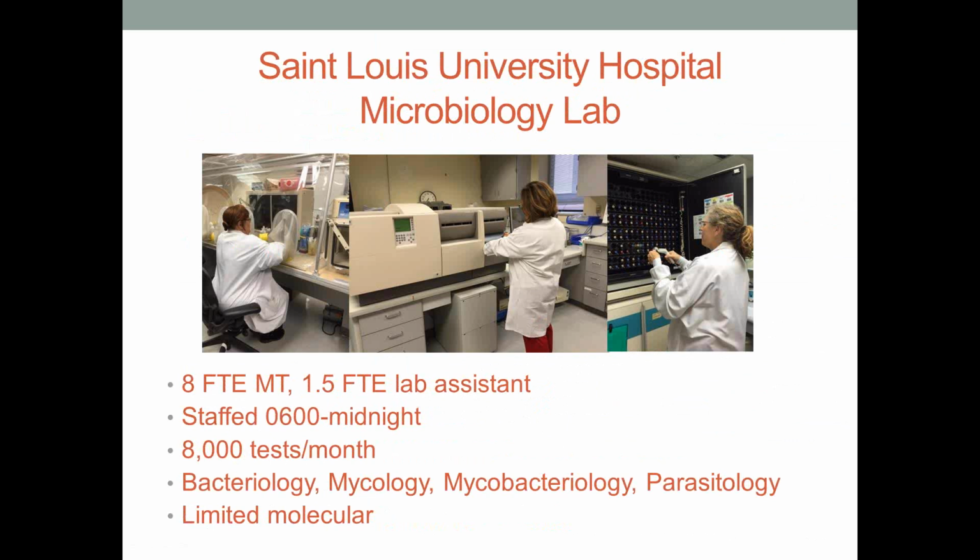Most of the molecular testing that we perform here is actually done in the pathology department molecular diagnostics lab, and a lot of that is in support of our transplant services. So we do a lot of testing for CMV, EBV, BK, and other viral pathogens, and also in support of our GI service. So we do a lot of hepatitis C viral load and genotype testing.